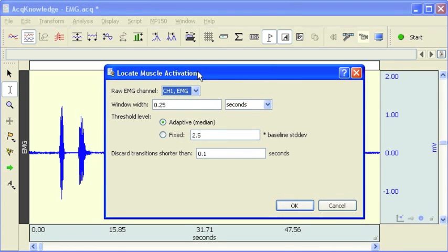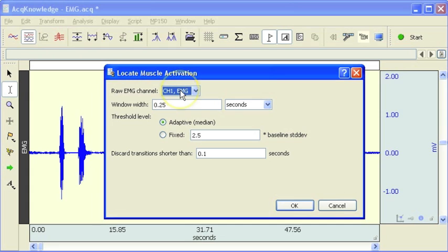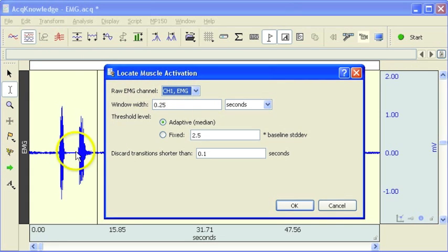First of all, it's going to ask you for the raw EMG channel. Well, in this case, we've only got one, so it's defaulting to channel 1.